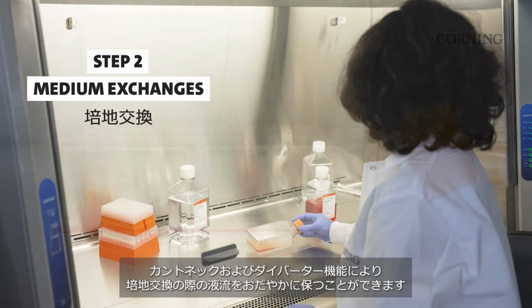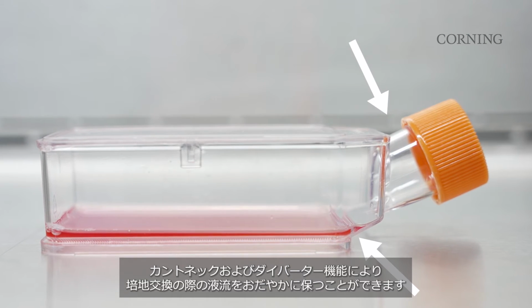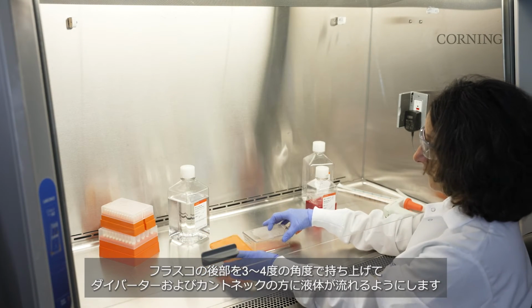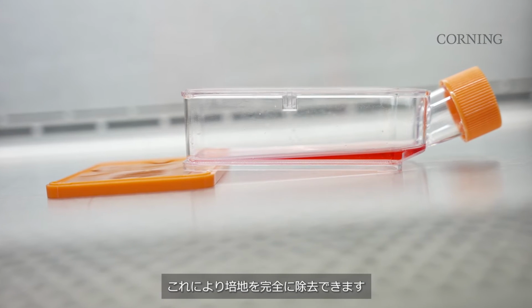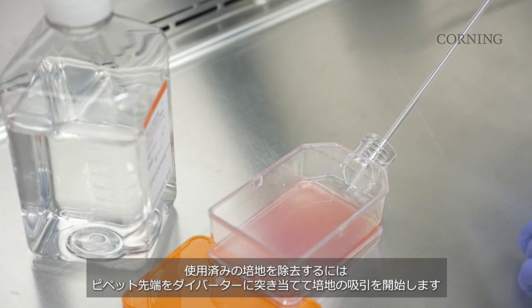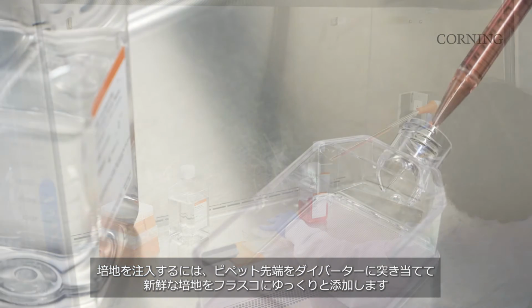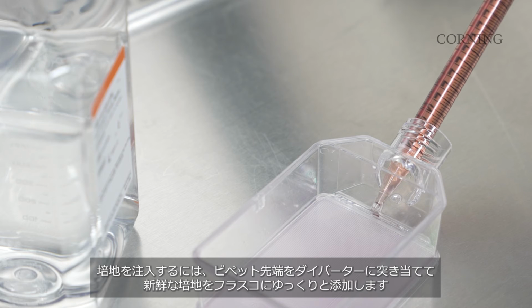During medium exchanges, the canted neck and the liquid diverter feature allow for gentle flow of medium into and out of the vessel. Lifting the back end of the flask 3 or 4 degrees drives the liquid towards the diverter feature and the canted neck to enable full liquid removal. To remove spent medium, place the pipette tip up against the diverter feature and begin to aspirate medium out. To replace medium, place the pipette tip up against the diverter feature and slowly add fresh medium into the flask.